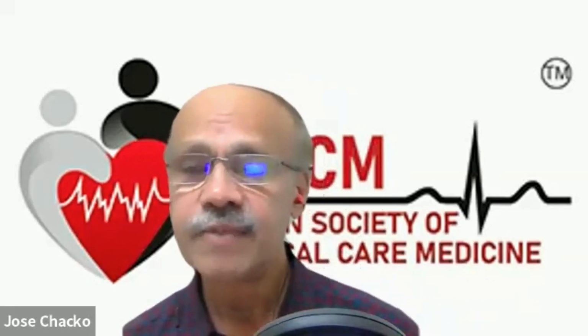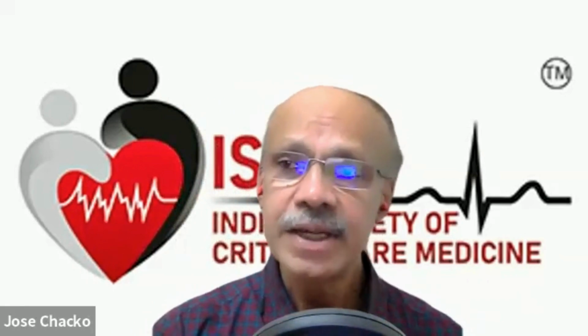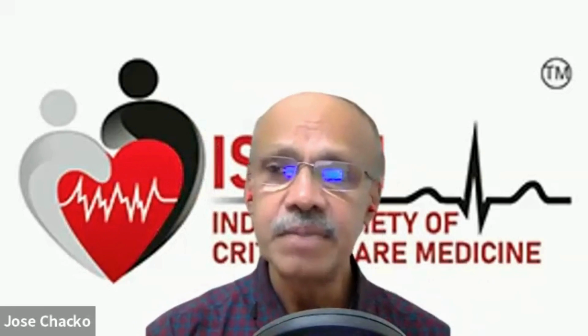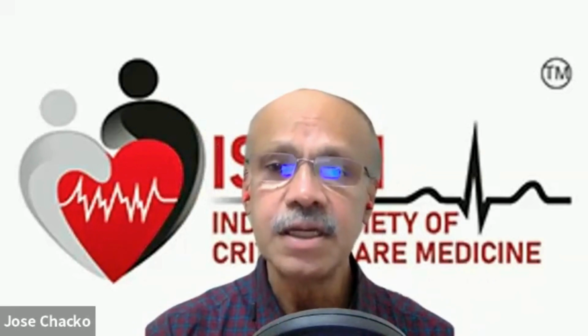And so far, from what we have observed, it's an extremely useful tool. You know, within a matter of minutes, you can tell if the lungs are recruitable and if a higher level of PEEP is going to help or not. So application of PEEP and titration of PEEP based on ultrasound guided recruitability is an important utility of bedside ultrasonography in the patient with ARDS.